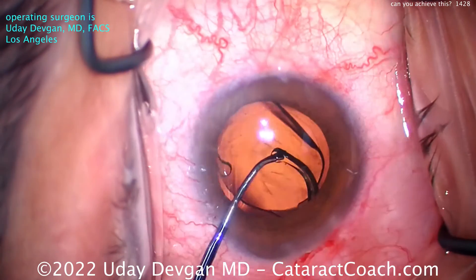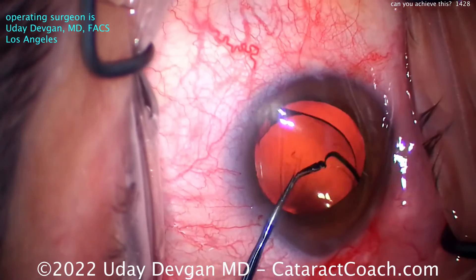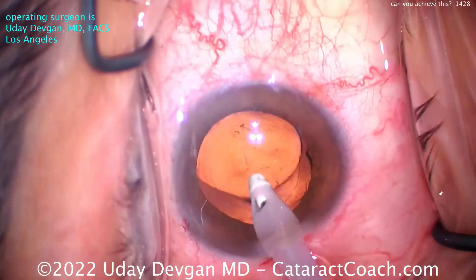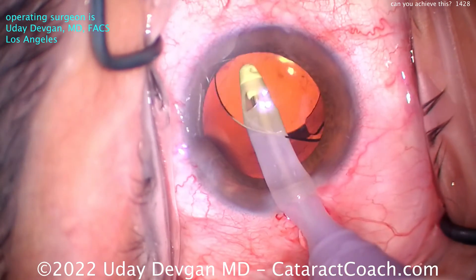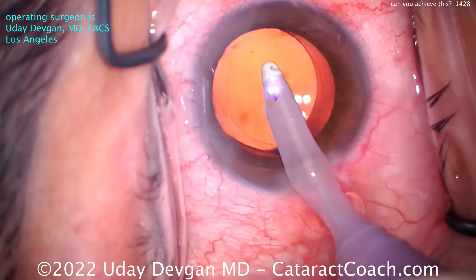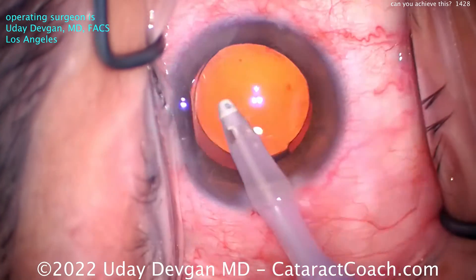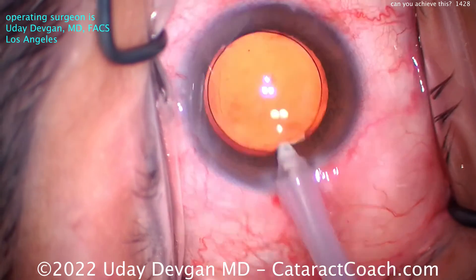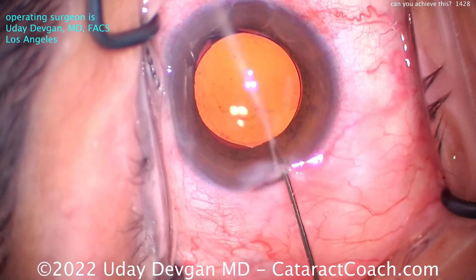We'll make sure that the optic and both haptics go completely within the capsule bag. We can rotate it through the side port, make sure that the trailing haptic releases. And you can see that rhexis overlap looks pretty darn good. So I think it's helpful to watch other people operate. If you're in that learning curve, set yourself a goal that you want to be able to achieve a case similar to this — more so the technique, not necessarily the time. This is an efficient case; we're done in about five minutes or less. But even if it's 15 minutes, if you can do a case that has this kind of ballet to it with no wasted motions and a very efficient, reproducible technique, good rhexis and incision — remember those two things are your signature.